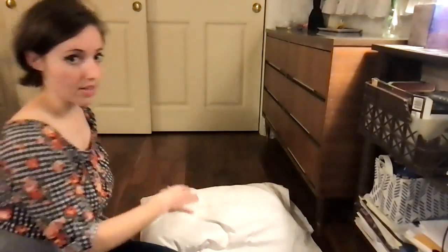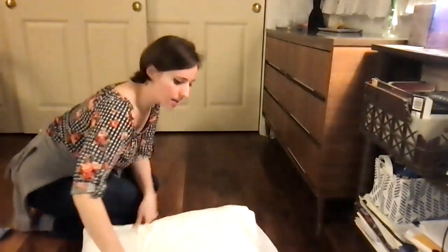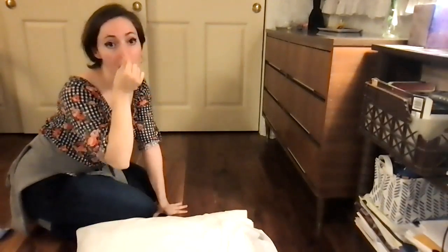First things first, you're going to come on scene and this person is either going to be already unconscious or you're going to see them collapse. The first thing that you're going to want to do is assess for responsiveness. So I'm just going to use my pillow as an example. You're going to come on scene and see that they're down on the ground, then you're going to tap them and say, hey, sir, are you okay? Are you awake? And you're going to be really loud and in their face.